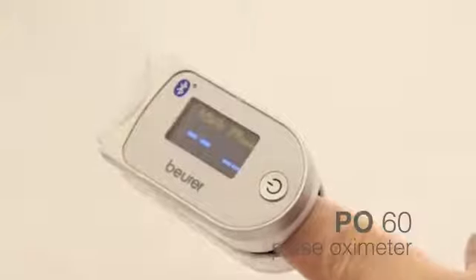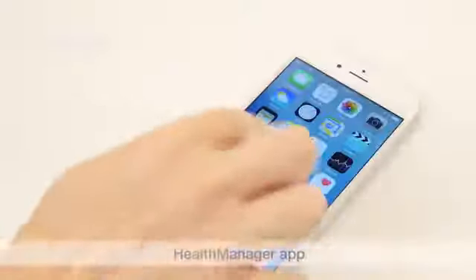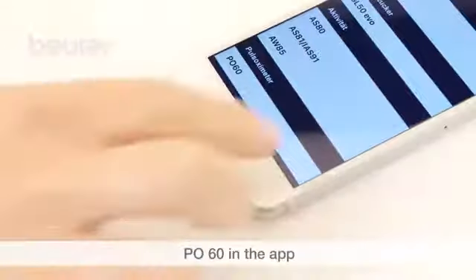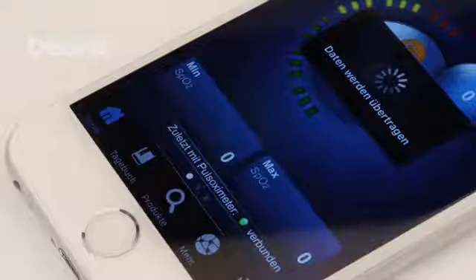Here are some tips for using your PO60 Pulse Oximeter from Beurer. Download the Beurer HealthManager app to enable full use of the PO60. Add the PO60 in the app settings. The measured values can only be transferred when the Health Manager app is open.